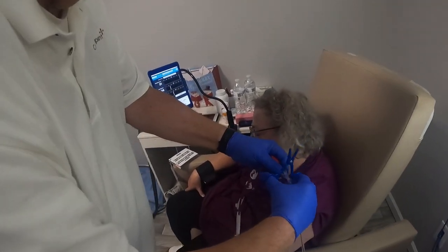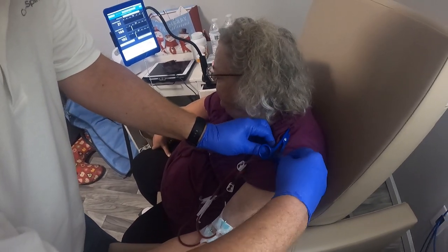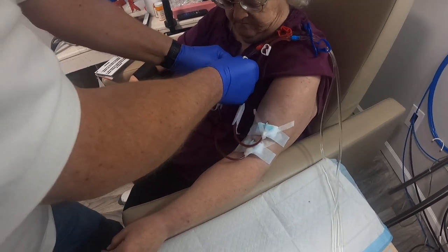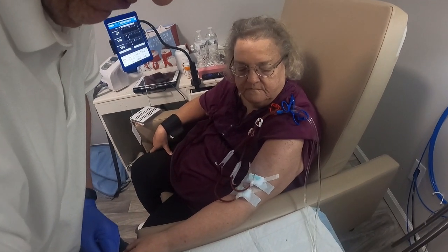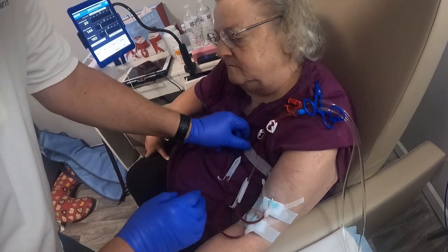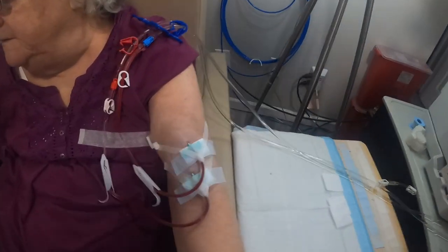Clamp this, the back side of it around the hose. The front side of it, you find the seam in her shirt. And then what you want is the red line here and the blue line here. Move these out of the way just a little bit. You take one piece of tape, taping it to her. These are open. You're ready to go. She's going to read me some notes. I'm just going to build up her.